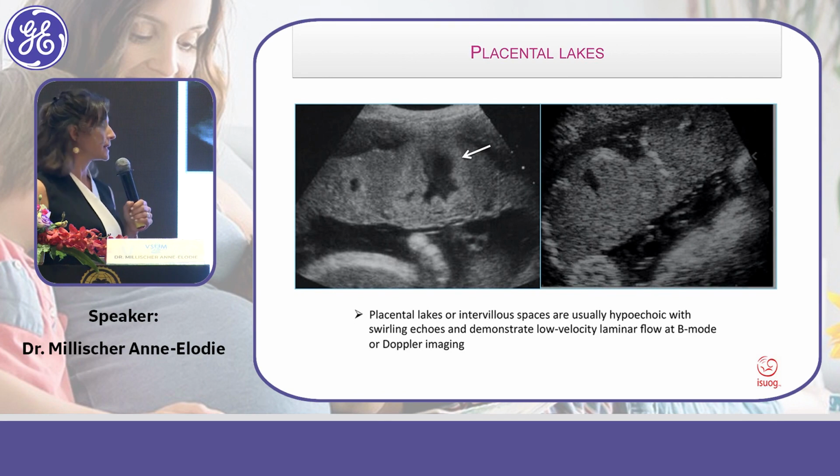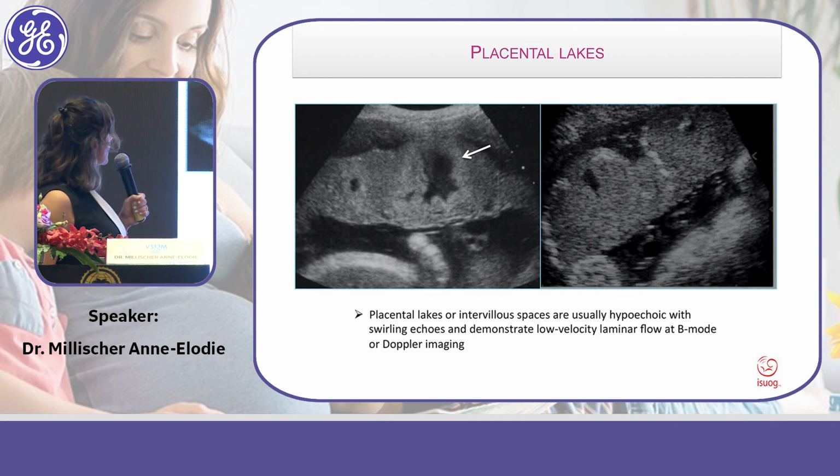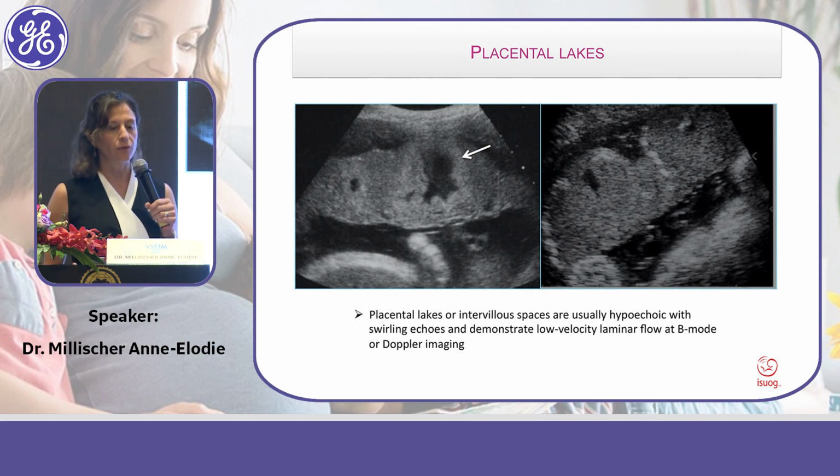Another aspect that everyone knows here is those placental lakes, which is very frequent.